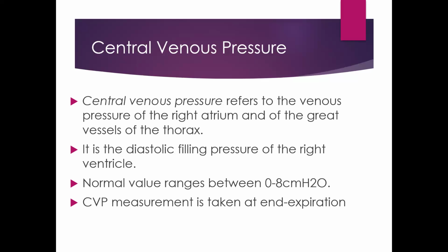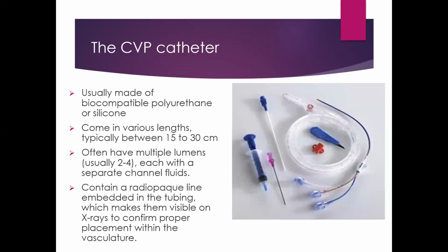It's important that your CVP measurement should be taken at the end of expiration to avoid the impact of respiration on the CVP measurement. The catheter, I'm sure many of us are familiar with this.